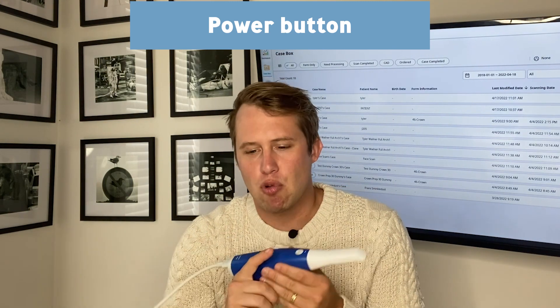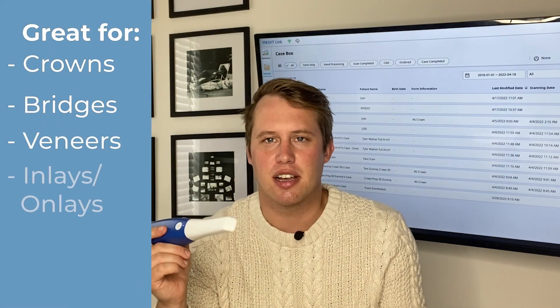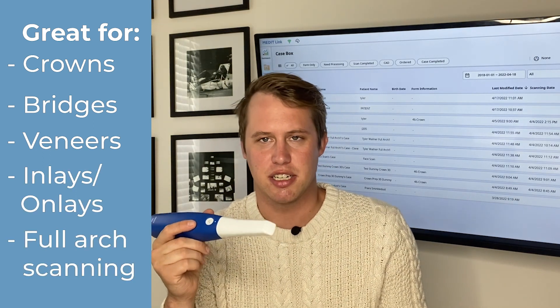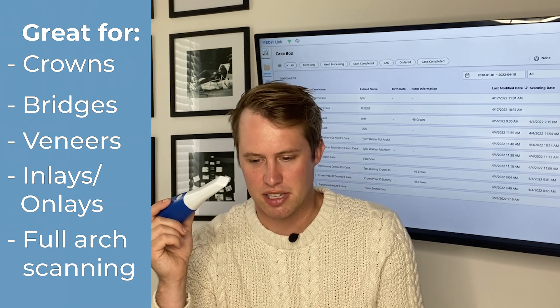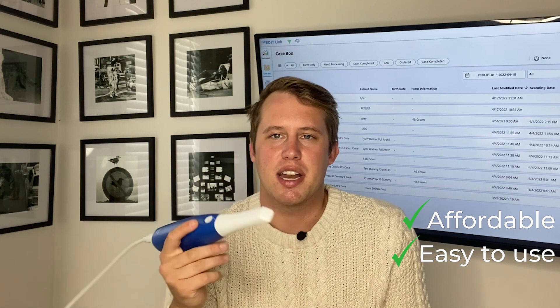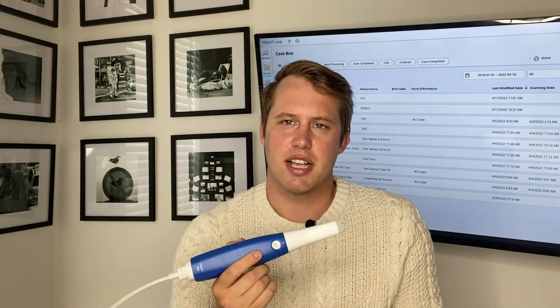It's great for any uses such as crowns, bridges, veneers, inlays, and onlays. The ability to scan full arch is really exciting and easy to do with the Medit i600 scanner. It's a low investment, it's easy to use, it's lightweight, and it feels very built with quality at the end of the day. So I'm excited to start scanning with it.